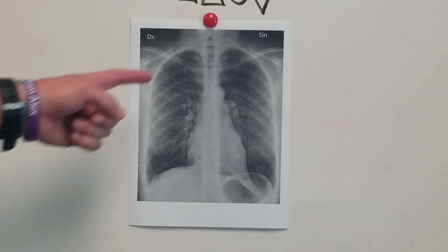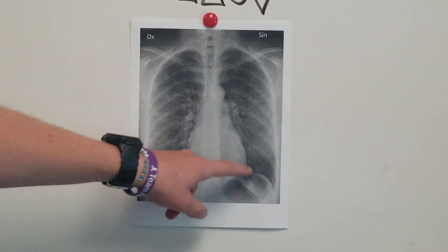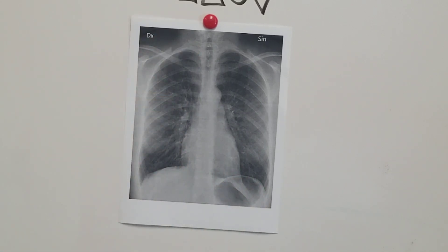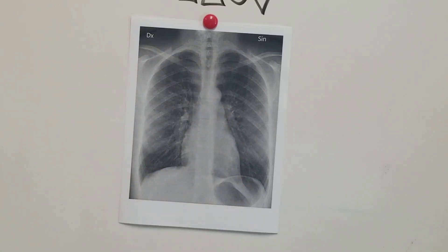So again, A through G — you do airway, bones, cardiac silhouette, check your diaphragm, look for extra things like extra tubes, lines, and devices, look at your lung fields, and last thing, look at your stomach. And that's A through G, how you read a chest x-ray. Thanks.